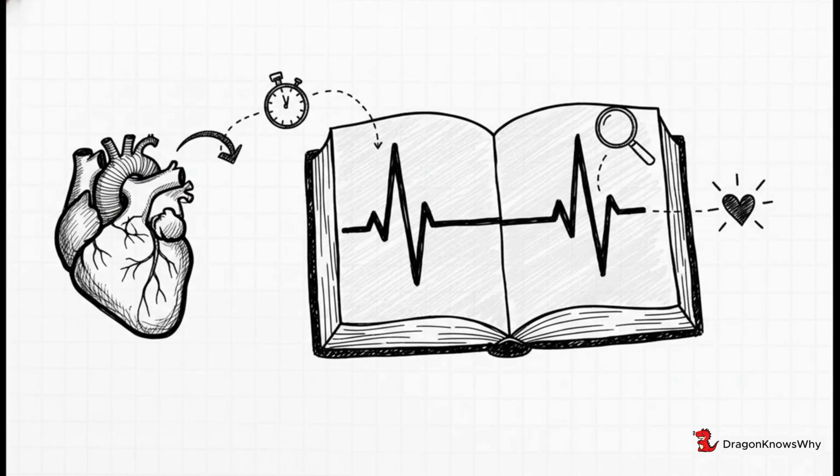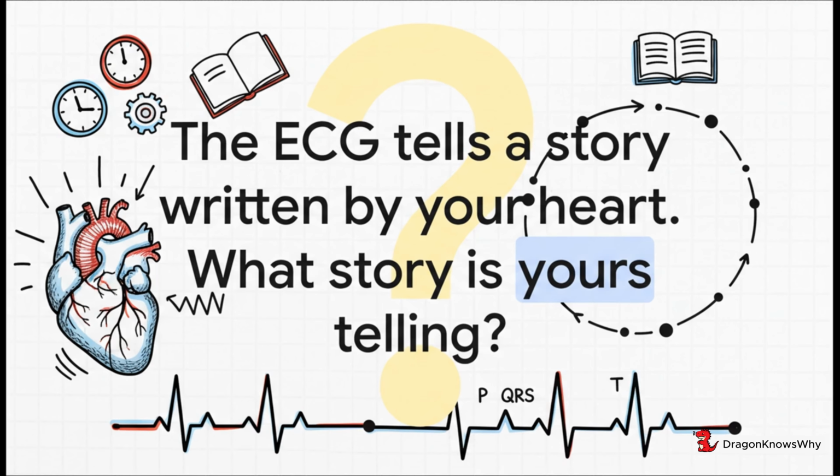So you see, in the end, the ECG is so much more than just a random squiggly line. It really is a story. Every single bump, every spike, every little interval, they all tell a chapter. From the basic rate and rhythm all the way to the specific shape of each wave, it gives doctors this powerful, totally non-invasive look deep inside your heart's electrical system. You know, it's a story that's being written in real time, second by second, beat by beat, by your very own heart. It communicates everything: problems, good health, a person's history, all in one simple tracing. And that just leaves us with one final thought to ponder. What story is your heart telling?